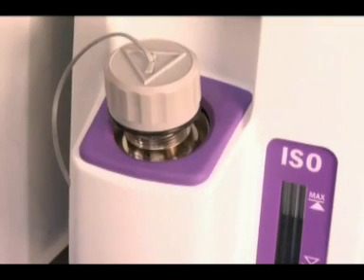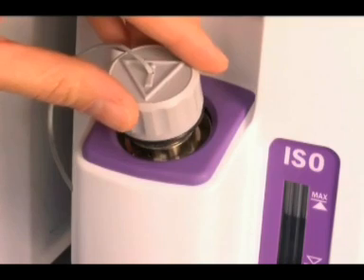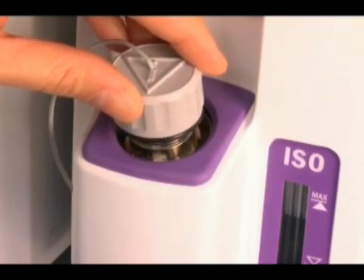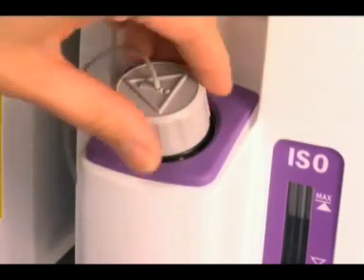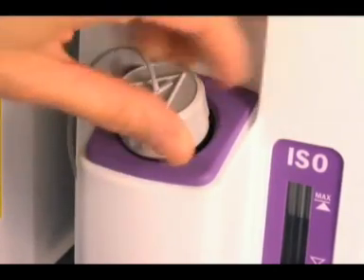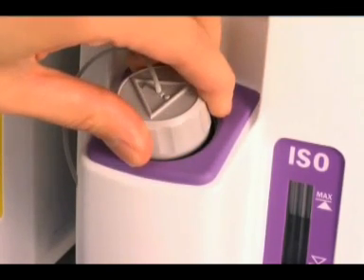Leaks. The most common cause of vaporizer leak is a loose filler cap, which can cause leakage of anesthetic gas vapor to the environment and can potentially result in patient awareness during anesthesia. Make sure that each cap is closed appropriately.